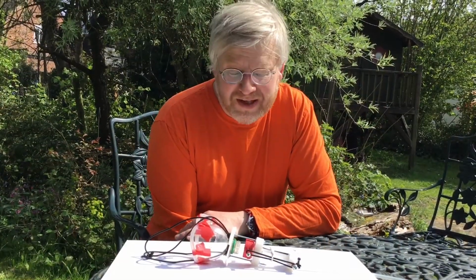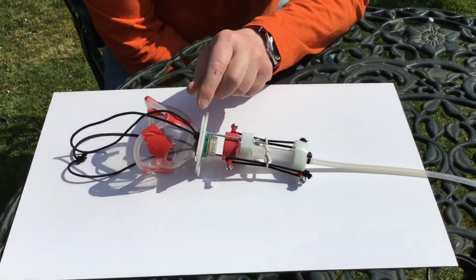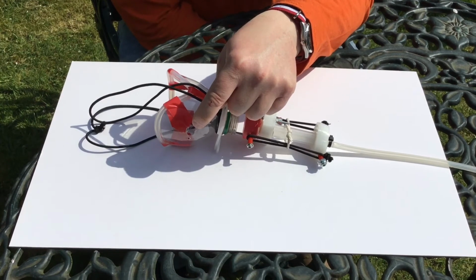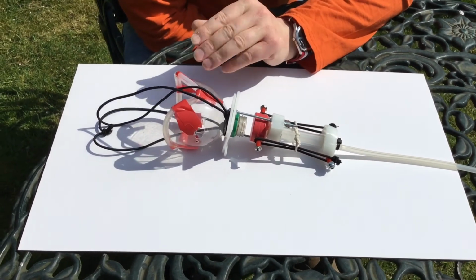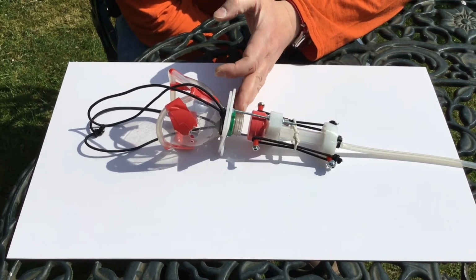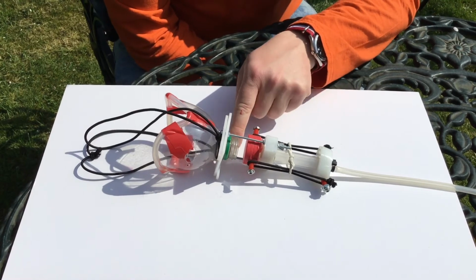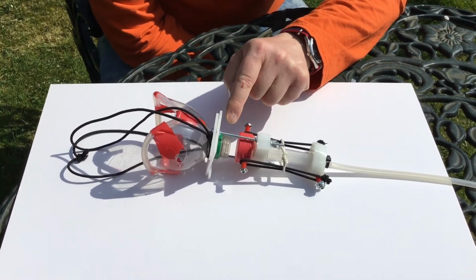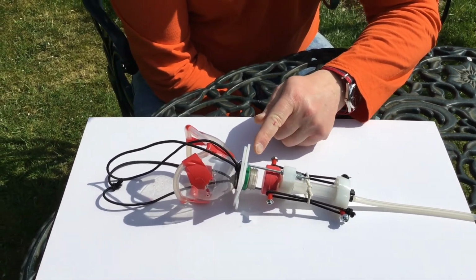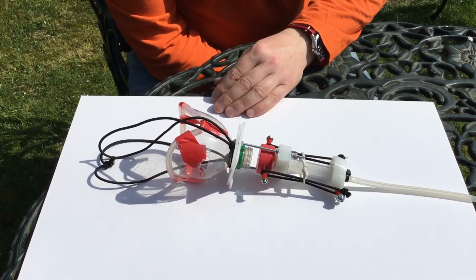Okay, there are obviously plenty of areas for potential improvement, but 4 I could find straight away would be: 1, looking at the possibility of using a 3-litre bottle rather than a 2-litre bottle here. 2, engineering an improved stroke working inlet port. 3, reducing the mass on the moving parts of the syringe, because every time that mass comes to a halt on the seat of the valve, it sends a vibration into the face of the wearer. And 4, looking at the possibility of working with 3 rather than 2 supports here to stiffen up the structure. However, that might compromise the quality of the seal achieved, so it might work better with 2, but it has been an experiment worth trying. Obviously, there are plenty of other areas as well.